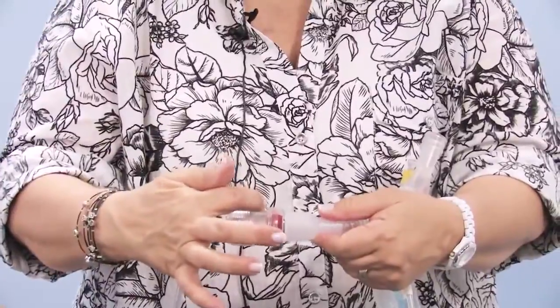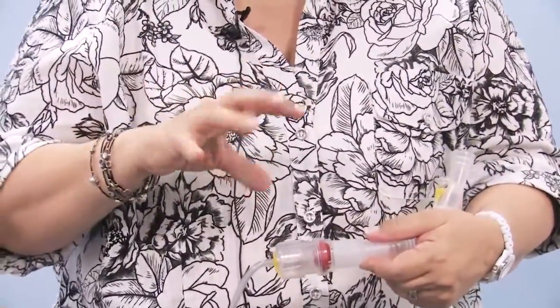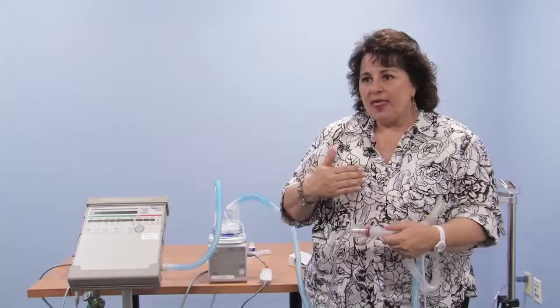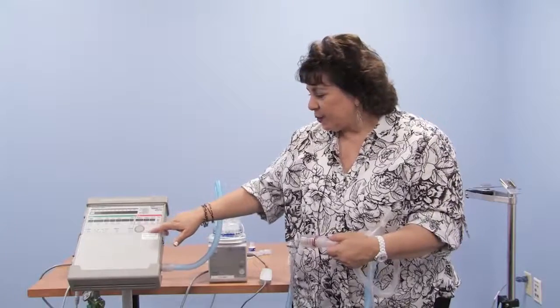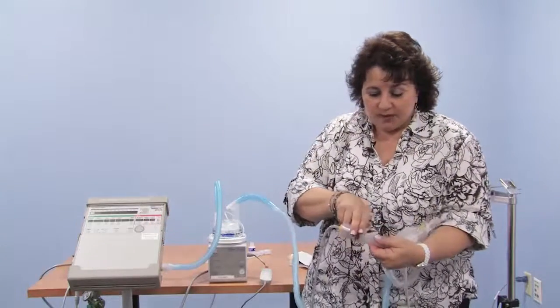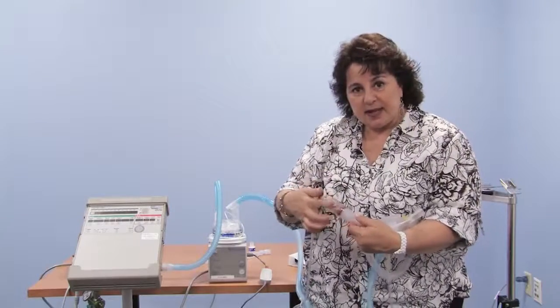So this will be set here. On the other version that we'll go over in a minute, and we'll look at that one for transport and for outside the home, you actually set the PEEP right here. It has a place for it right here. But the exhale valve looks very similar to this one. It just doesn't have the PEEP setting.